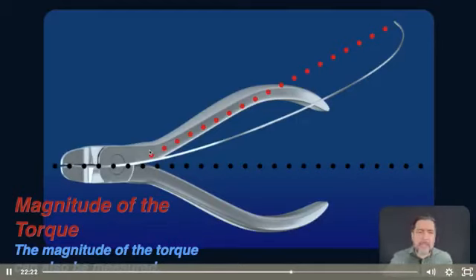In this case, something around 30 degrees of inclination of the angle in relation to the center. And this is really a good torque for the lower, but maybe excessive torque for the upper sometimes. But again, it will need to be measured in a relative environment that we're going to refer to in the next class.